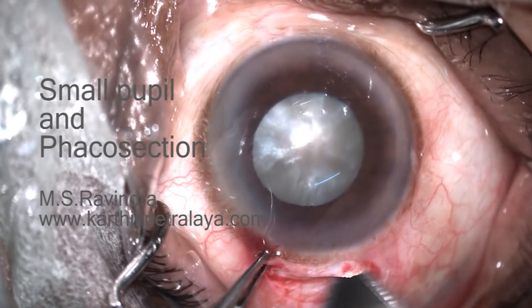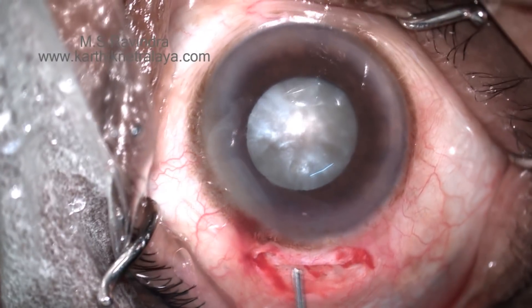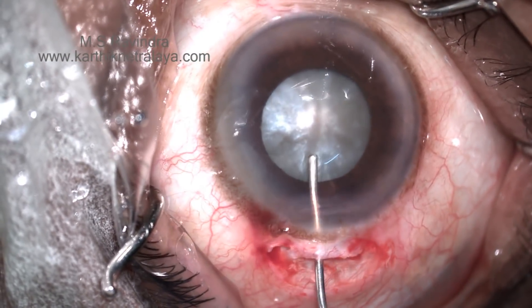Presence of a small pupil in cataract surgery is always a challenge. Let us see how to manage it in phacoemulsification.